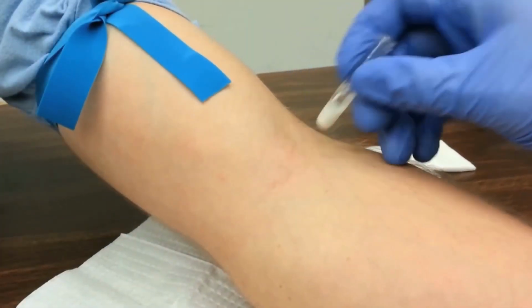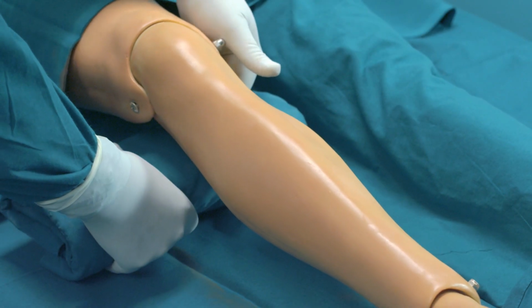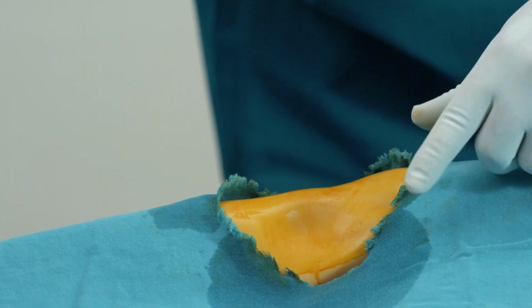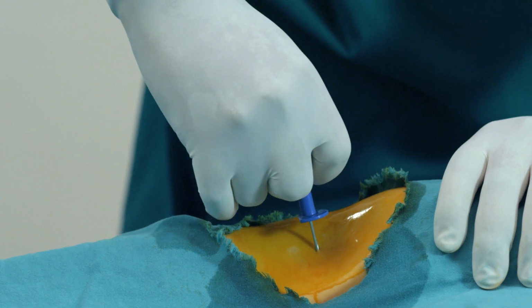The first option for vascular access is through a peripheral vein puncture. If this route cannot be used, or if a prolonged period of access is necessary, then the intraosseous route is an effective option for rapid and safe venous access.